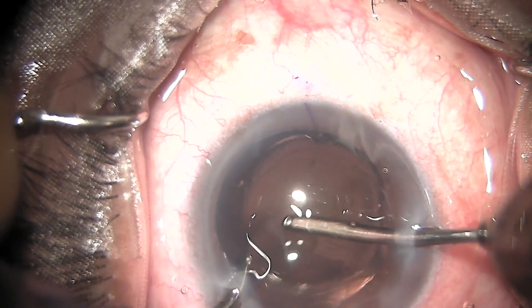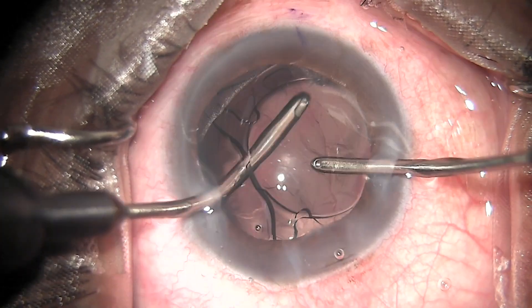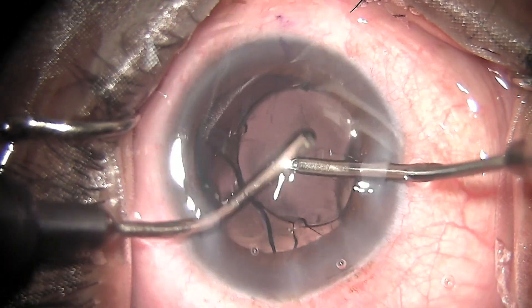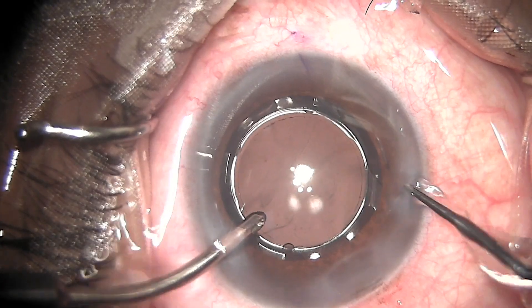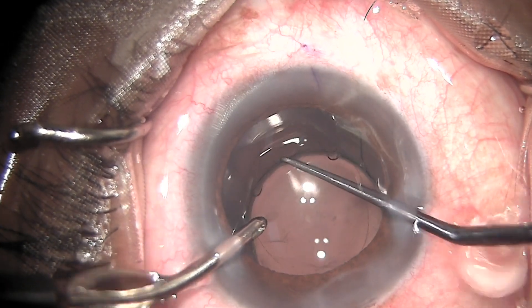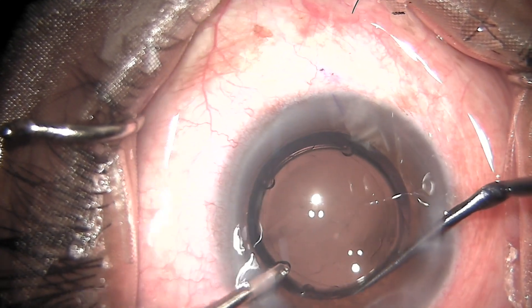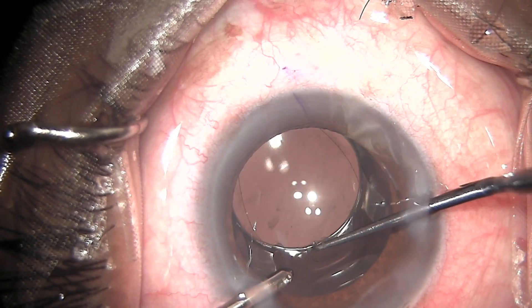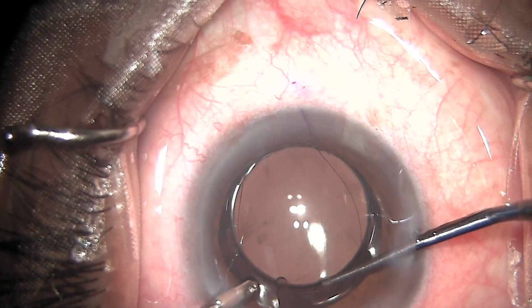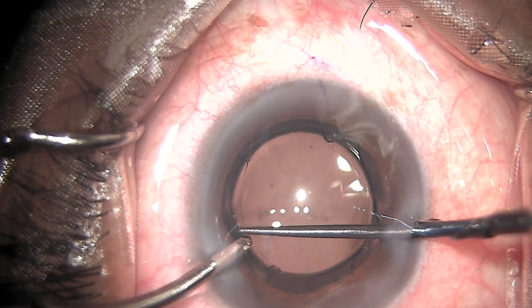Here, unlike your routine phacoemulsification, we need to remove the viscoelastic behind the lens first before engaging the clips of the lens. Once the visco is removed under irrigation, I am first pulling the clip on the nasal side and placing it over the anterior capsule, followed by the clip on the temporal side. You can see that it can be easily pulled over the capsule and fixed.